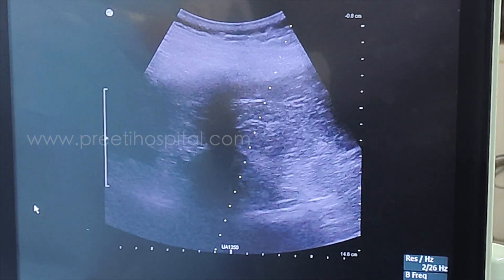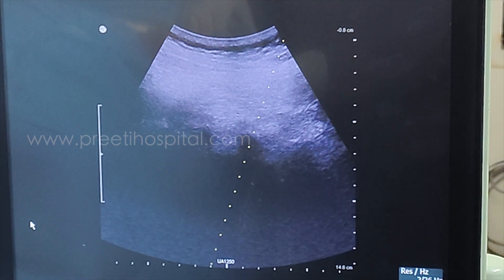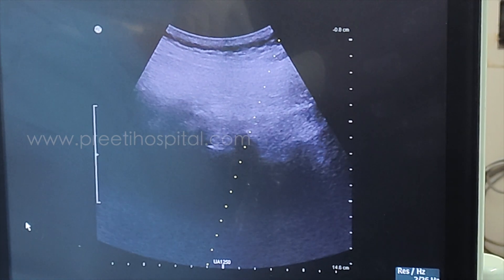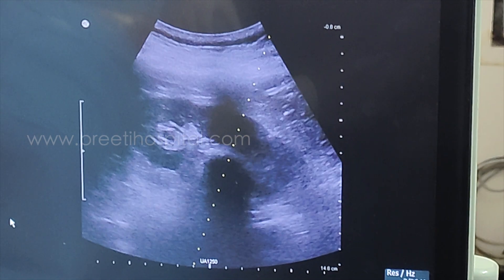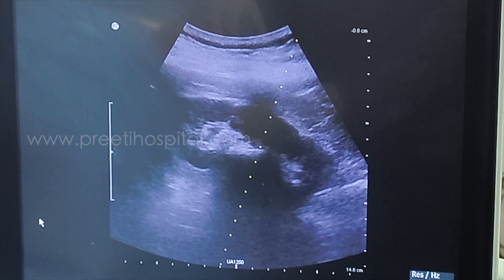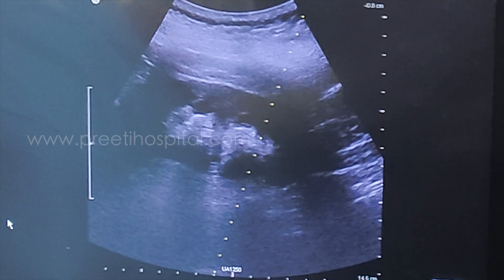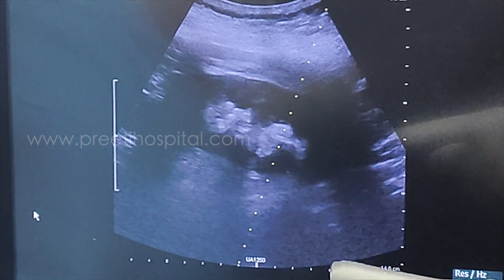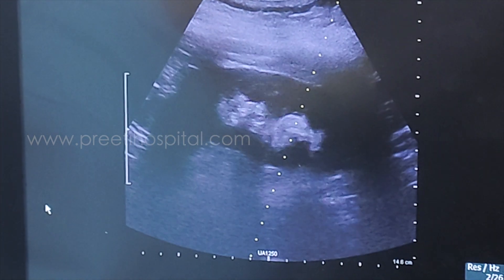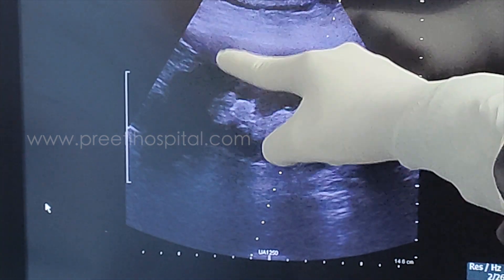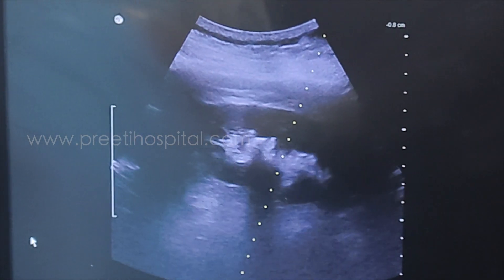If you go more posteriorly, unless you look like this, it will never be seen in supine position. If you turn only, you can see — this is what is the prone position. In prone position, the upper pole is more nearer to the skin, and the lower pole is more away from the skin. This is the basic point.